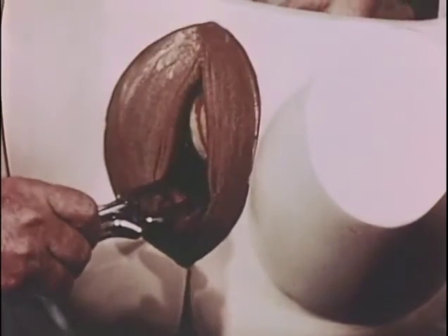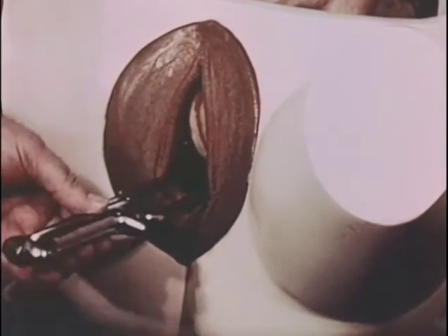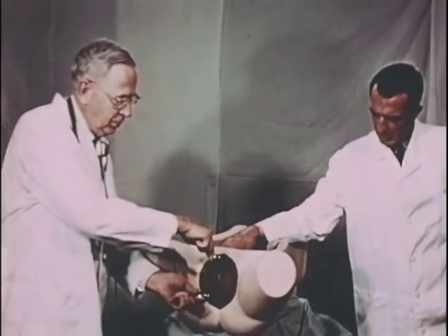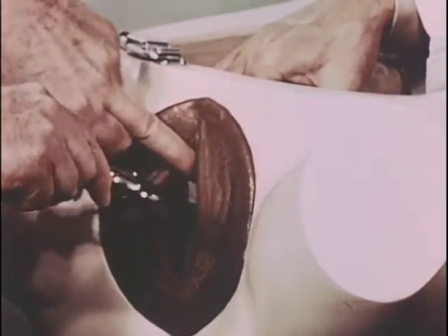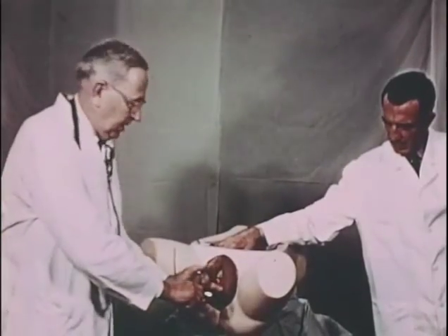Now, the sagittal suture is anterior from 12 to 6. But the fontanelle is more than a finger's breadth in front of the plane of the shanks, so we make that correction by unlocking the handles, elevating the top one first to the level of the posterior fontanelle, then bringing the posterior handle up to it and relocking. Compression of the handles with depression, and we find that the posterior fontanelle is in its proper place, a finger's breadth in front of the plane of the shanks.